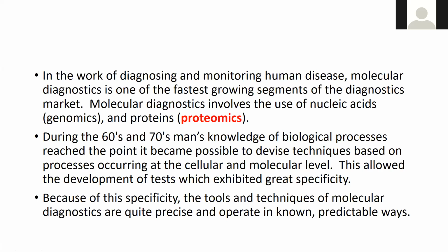One of the things that we really get excited about is when we can take you to AEL, the esoteric reference lab over in Memphis, and their micro department has this, I don't know if they call it the behemoth, but it's this big room of just a thing. It's almost like a factory in there. It's video, so you don't have to go to the plate itself unless you're going to pick a colony. It monitors it. So you're watching a computer screen and looking for the growth of the plate as it moves by.